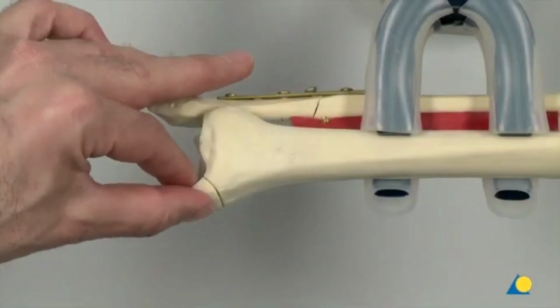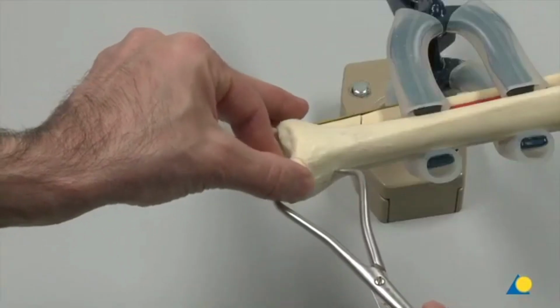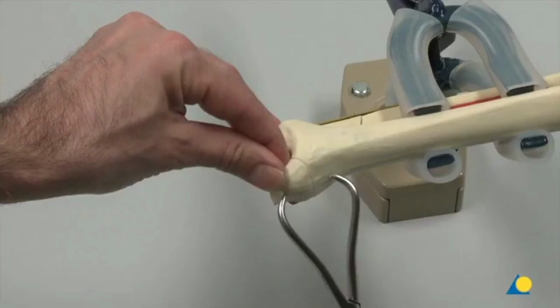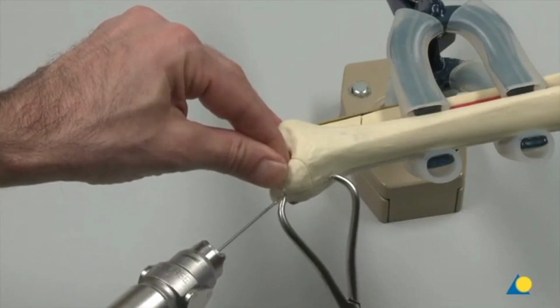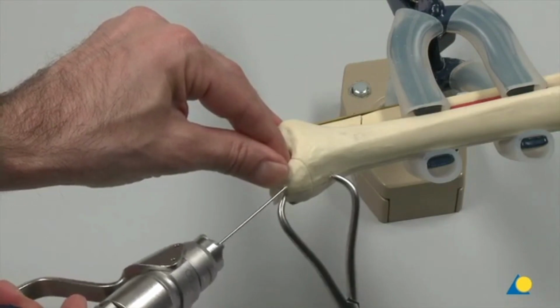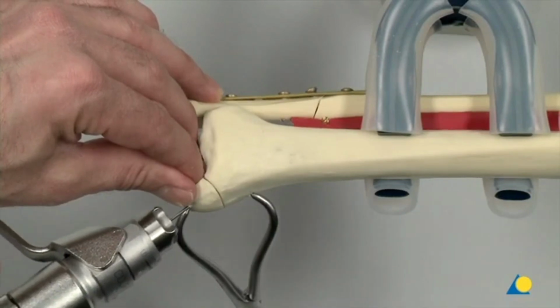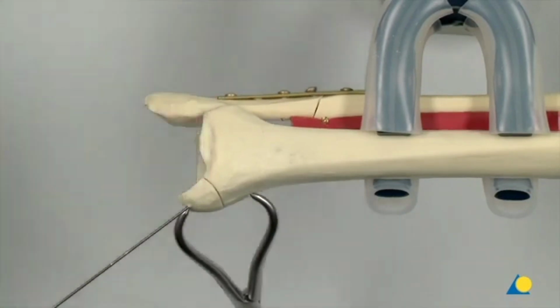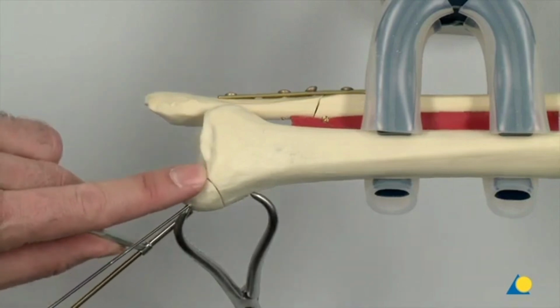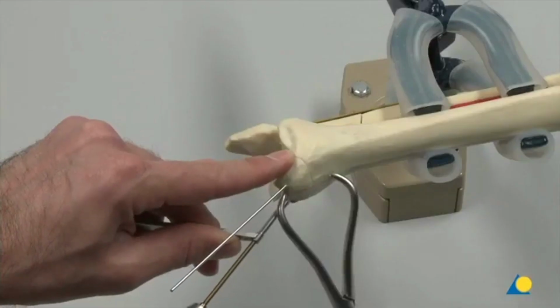The fracture is reduced anatomically, clinically using pointed reduction forceps. A 1.6 mm K-wire is inserted to secure the preliminary fixation. Take care to ensure that the K-wire does not go through the joint. The 2.5 mm drill bit is used to drill a hole for the 4.0 mm cancellous bone screw parallel to the set K-wire.